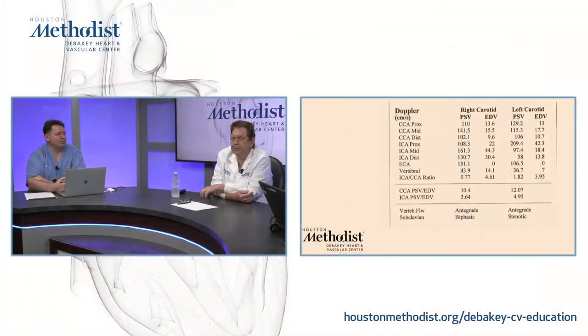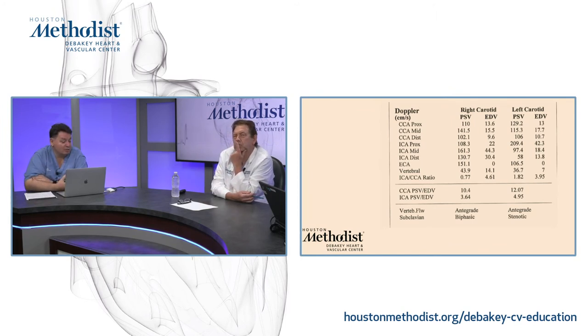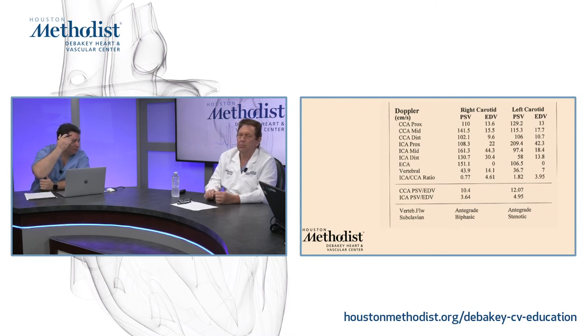Mm-hmm. So the ECA is a huge collateral pathway, and I think it's very interesting in the younger patients, we can see the ECA even sometimes with lower resistance. So when we really become older, we can see the resistance is really high, but in younger patients, we see low resistance ECA. With our busy neurosurgery practice, you will be surprised to see a low resistance ECA. Let's see, an external-internal bypass. Yeah. And things like ECA stump syndrome are, I mean, pretty uncommon.